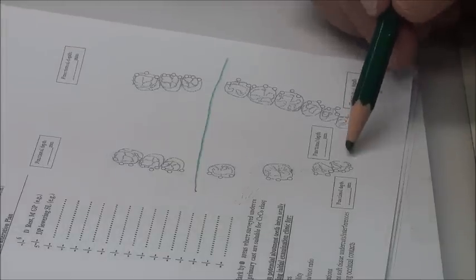Okay? A major connector here. Bar. How are you going to connect a bar to this area? It became a plate. Whenever we have an anterior bounded saddle area, it becomes a plate. It's no longer a bar. Here. It's a plate. Major connector is no longer a bar, it's a plate. One of the indications for plating, anterior saddle area. Okay? The lingual. Yeah?